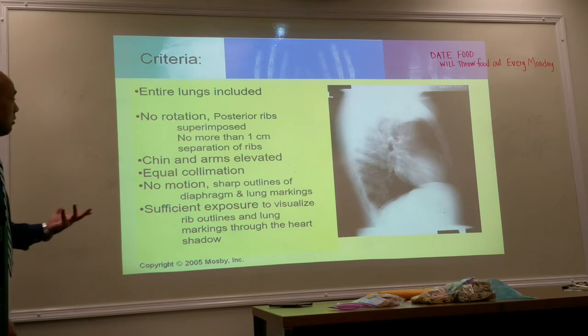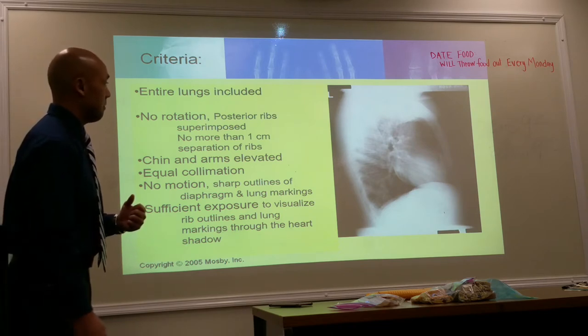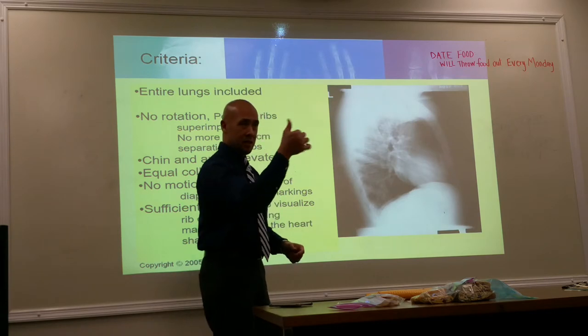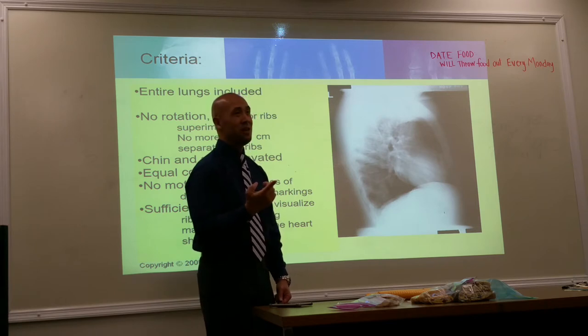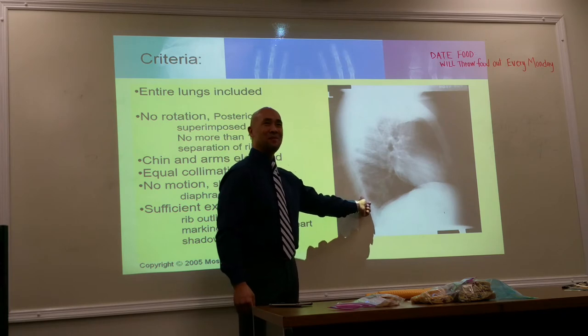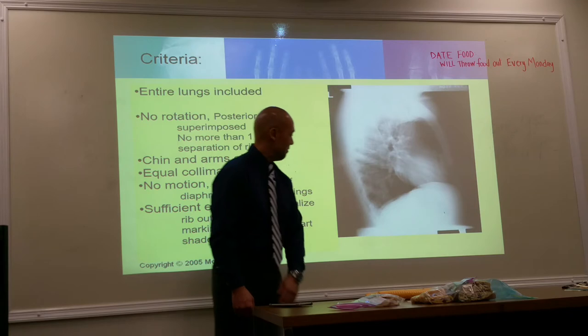Okay? Any questions here? Is this an acceptable X-ray? It's a very acceptable X-ray. Aren't there two sets of posterior? No, there's only one. Okay, but again, the thing is the rule of thumb. Okay. I'm witty. Okay. 1 centimeter separation, it's acceptable. I only see one set. Yeah. Where's the second set?